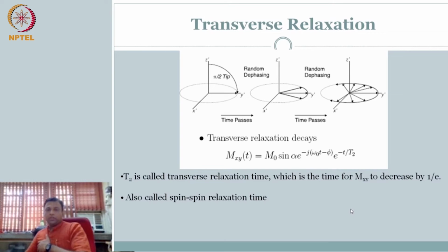So now the question is, okay, that is all fine. There is a small change due to spin-spin interaction, and so it dephases. Then what does T2 star mean, right?